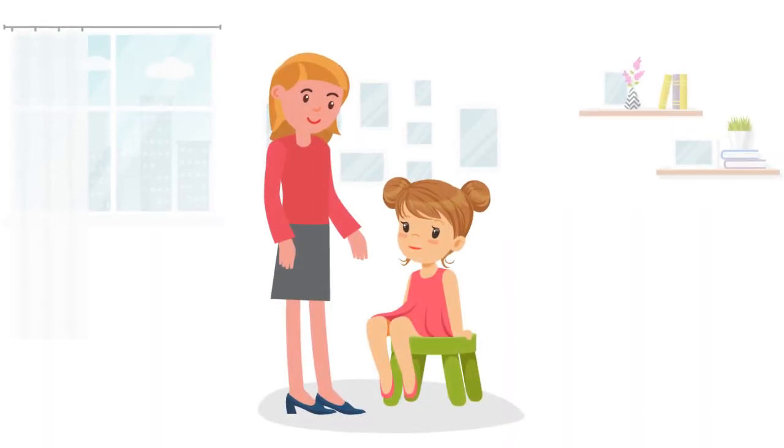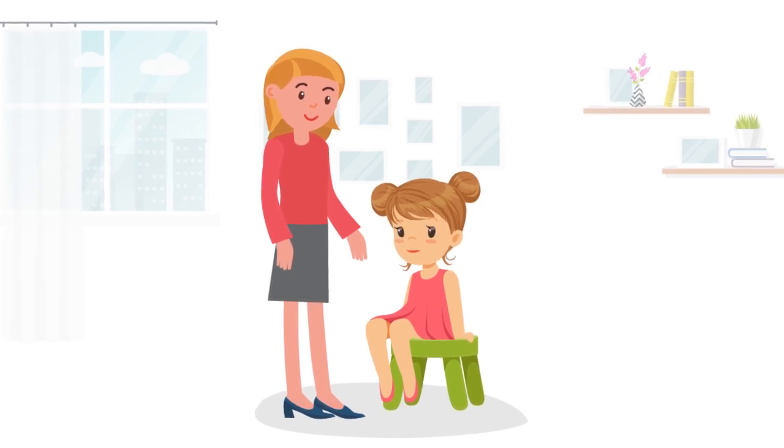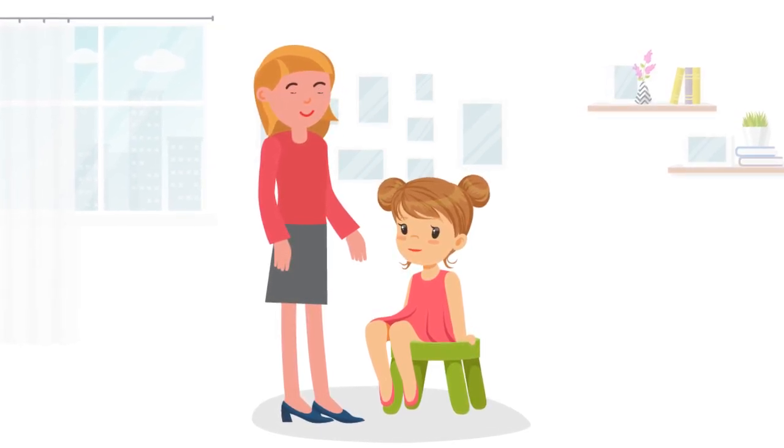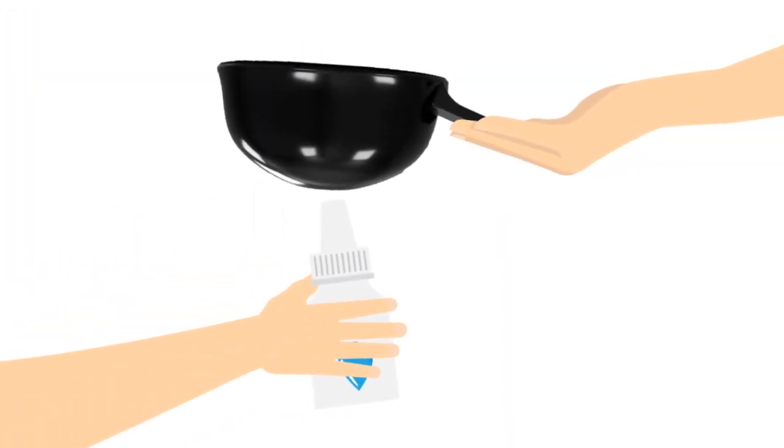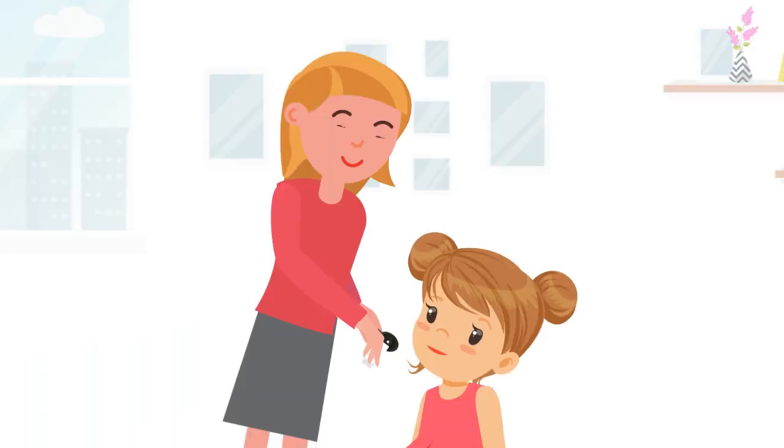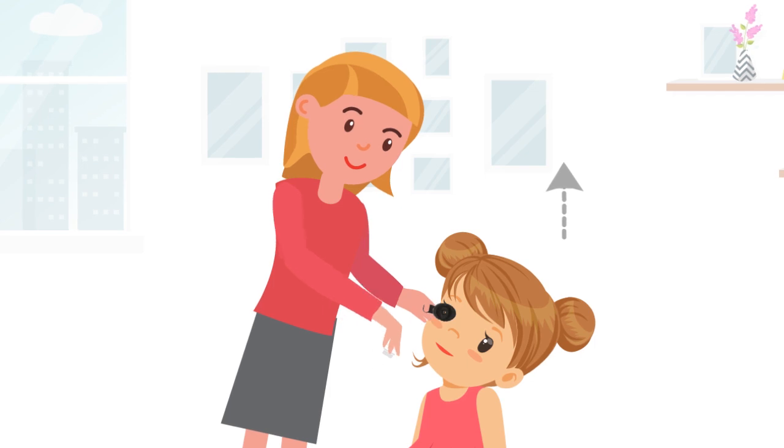It's also just as easy to help a loved one put drops in their eyes, like a child or an elderly individual. Have the individual sit or lie down. Pick up the EziDrops applicator and turn it upside down, and place the nozzle of the bottle into the EziDrops applicator. Ask the individual to look directly up at the ceiling.